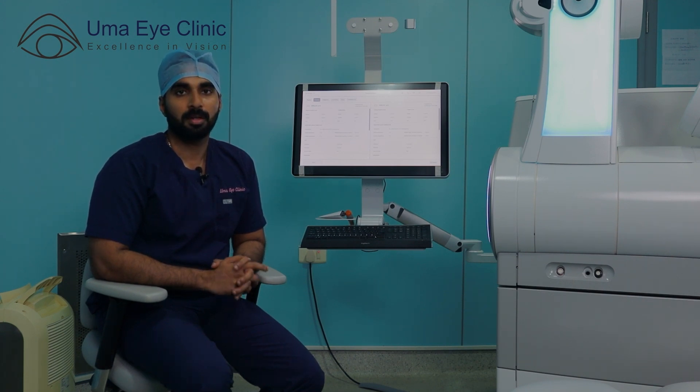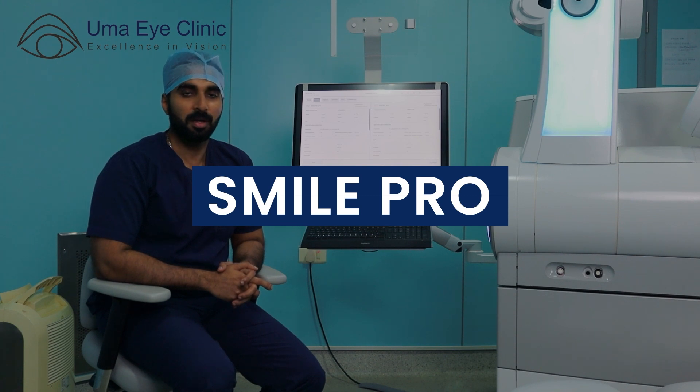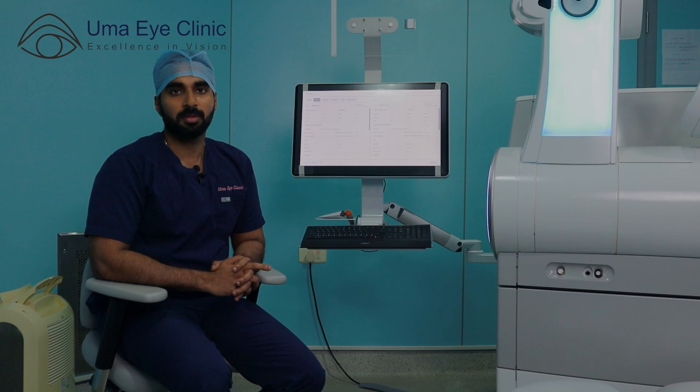In this video, we are going to perform a Smile Pro laser procedure. We are going to correct a patient with a high power.